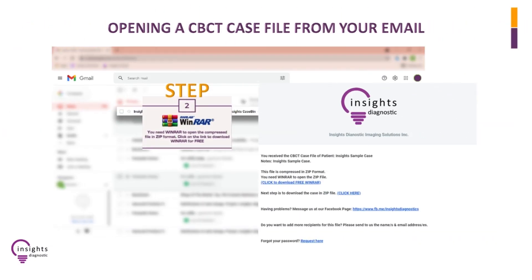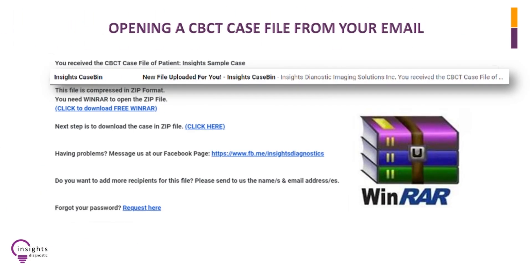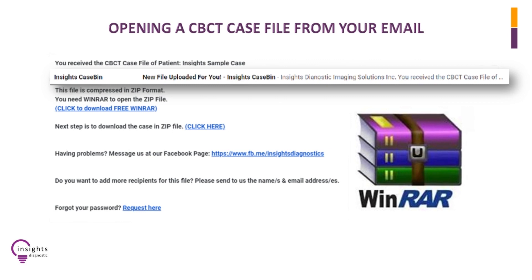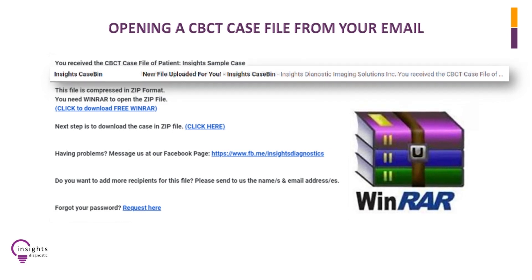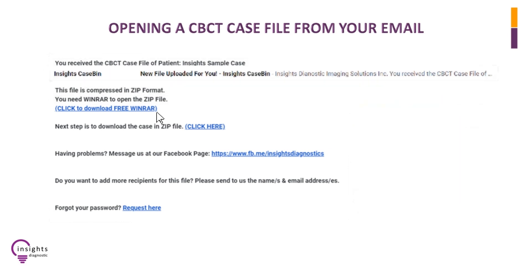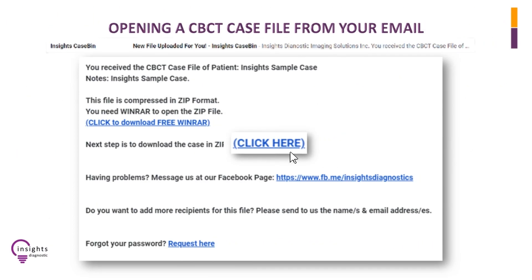Step 2: Click to open the email sent by Insights CaseBin. To open the CBCT case file sent to you in ZIP format, you will need to download WinRAR — just click on the link to download WinRAR for free. Step 3: To download the case, click the link highlighted in blue.